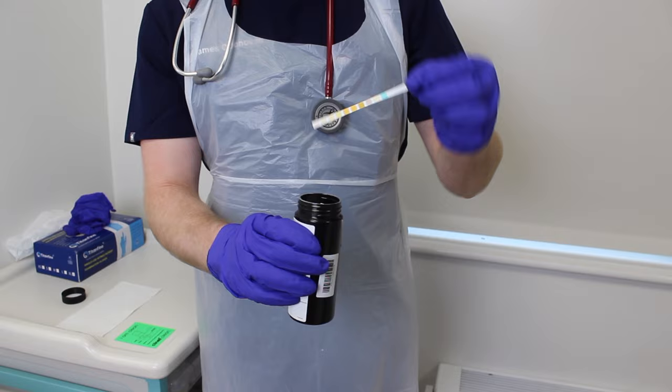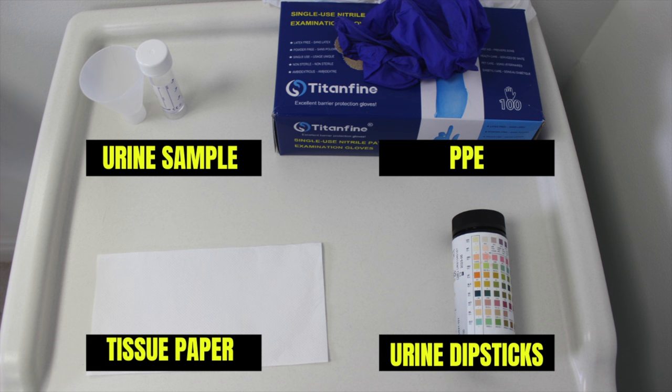In this video you're going to learn how to perform urinalysis. For this procedure you will require personal protective equipment, also known as PPE. This includes gloves and an apron, as well as tissue paper, the urine sample, and reagent test strips.